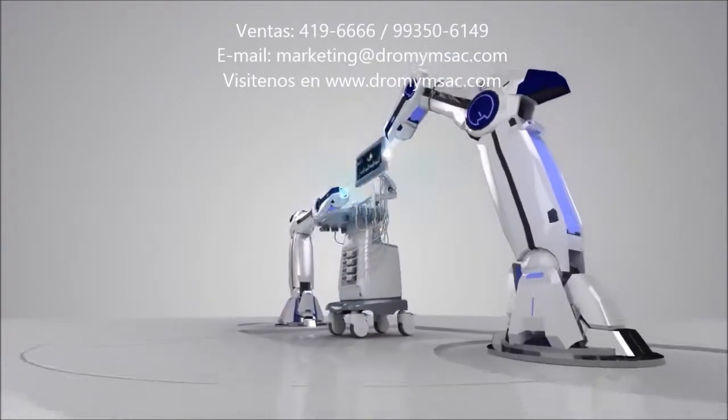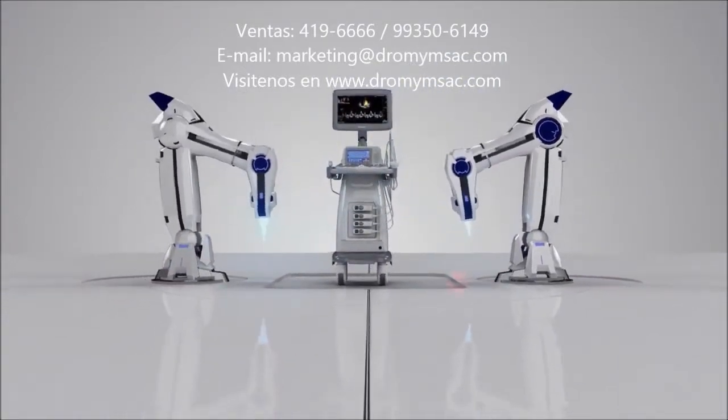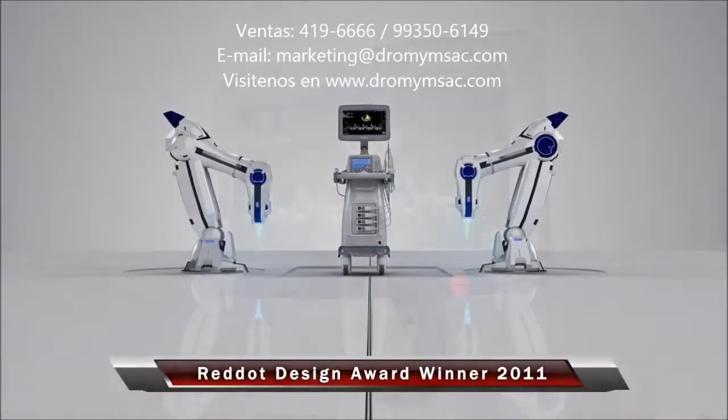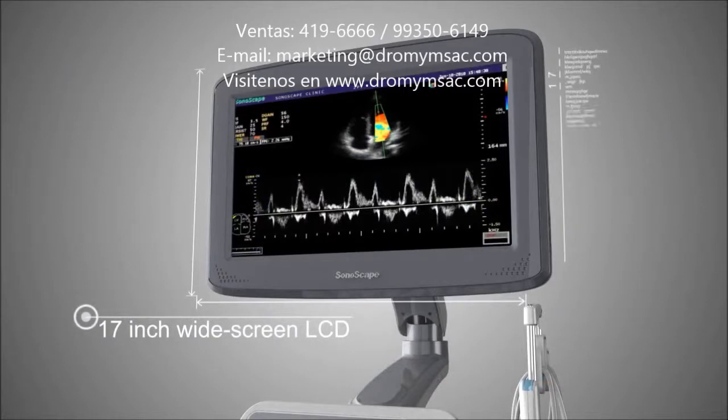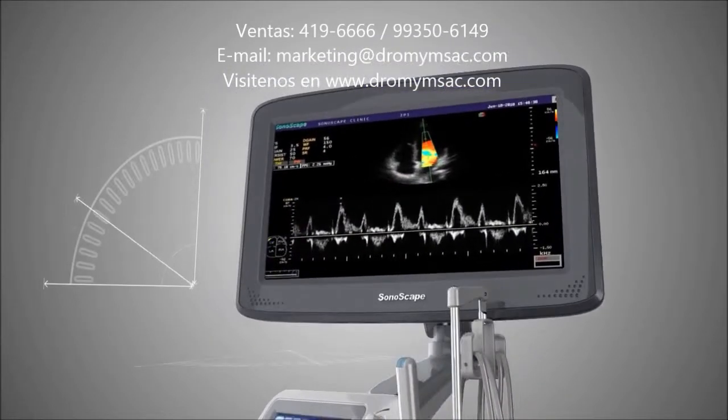This year, over 4,000 candidates, 1,000 companies from 60 countries ran for the award. S20 stands out in the competition and becomes a winner. S20 features a freely adjustable 17-inch HD LCD screen, minimizing vision fatigue.